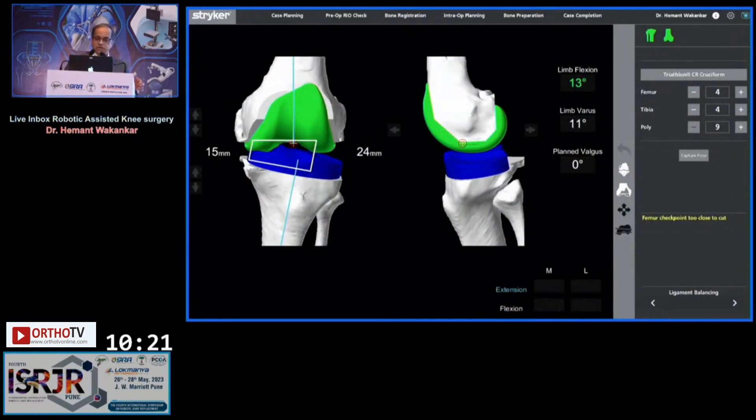But the knee is lax. Although there is 13 degrees of fixed flexion deformity, there is still significant laxity. As you can see, on the lateral side it is 24 millimeters. Our target aim is 18 millimeters. The magic figure we have in MAKO is that we are aiming for 18 millimeters of gaps both in flexion and extension, medially and laterally — that is what gives us the balanced gaps.